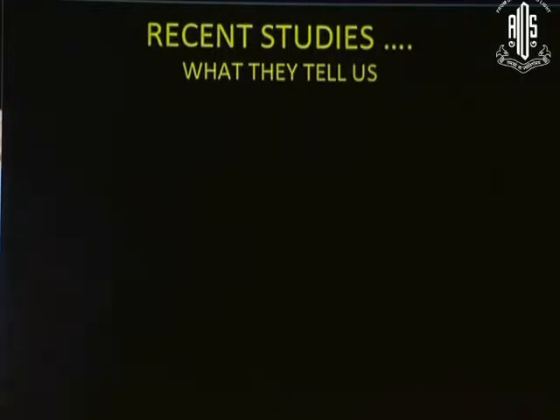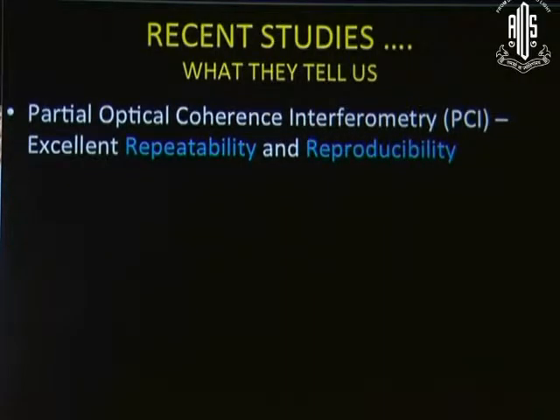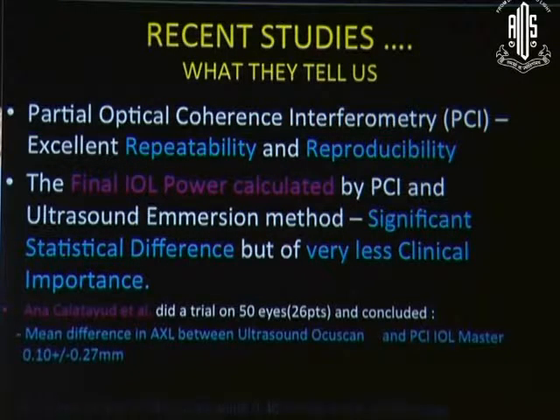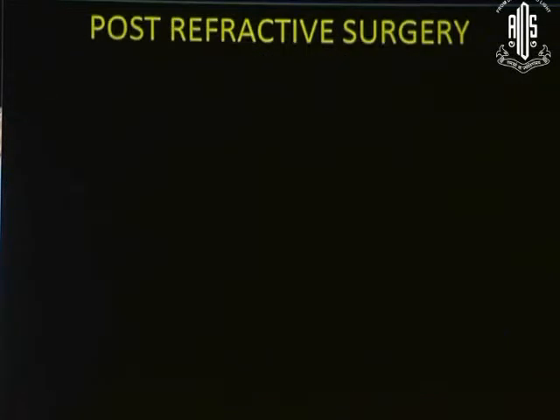Now, what do the recent studies say? The PCI is supposed to be excellently repeatable and reproducible. And for the final IOL power calculation by the PCI or the ultrasound immersion, a significant statistical difference is there, but very little clinical importance. So this is one point that we need to note. However, we need to go on, and therefore, let us use the PCI in most of our cases.